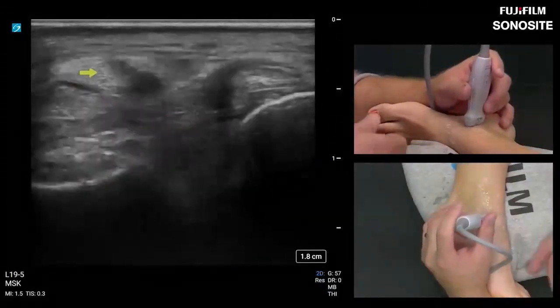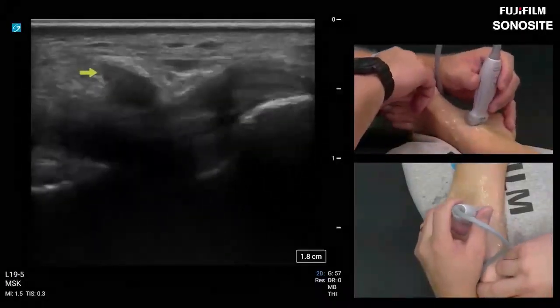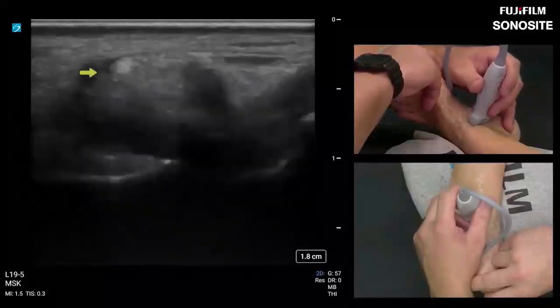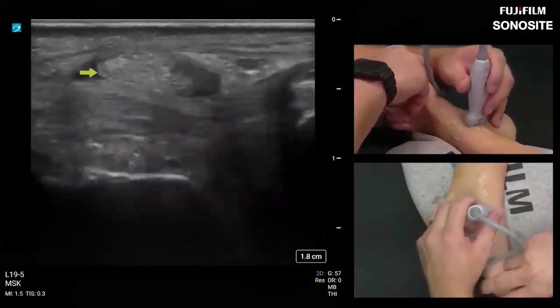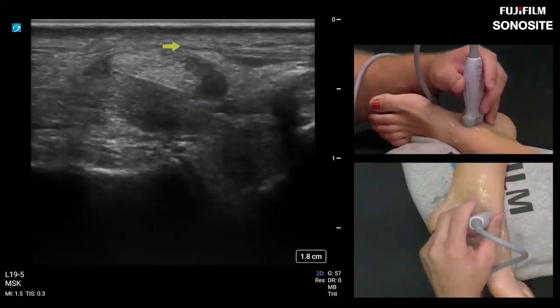And if I grab the big toe and metatarsal and invert the foot a little bit, it will typically cause a pooling of fluid around the tibialis posterior if you just wanted to see that tendon sheath. But right there in that corner, that's normal. Don't call it abnormal unless it envelops the tendon. So I would see circumferentially, I would see fluid all the way around the tendon if there was something wrong with it.